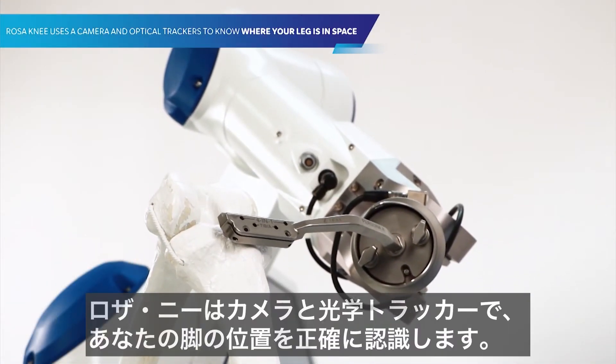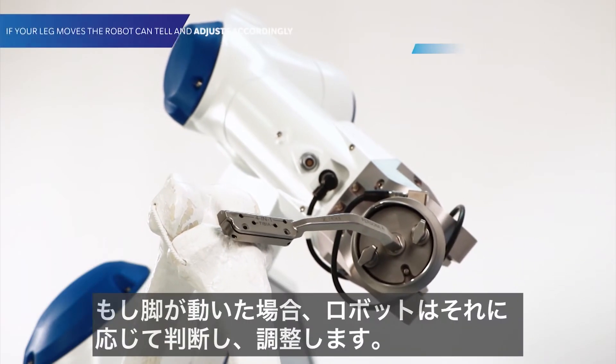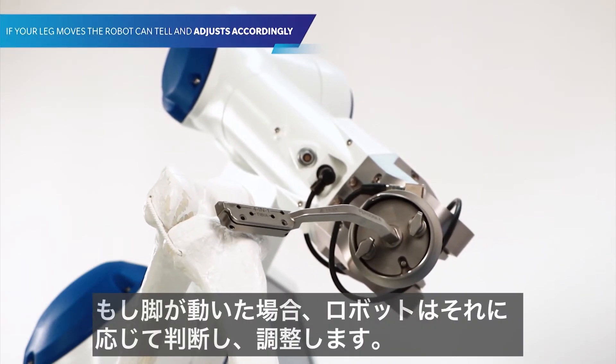Rosa Knee uses a camera and optical trackers to know where your leg is in space. If your leg moves, the robot can tell and adjusts accordingly.